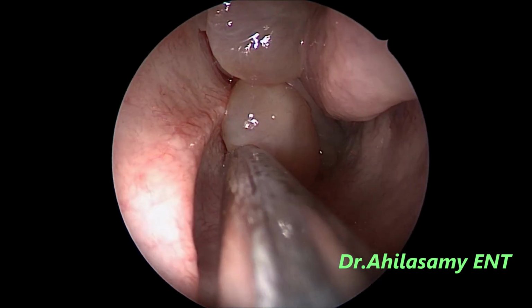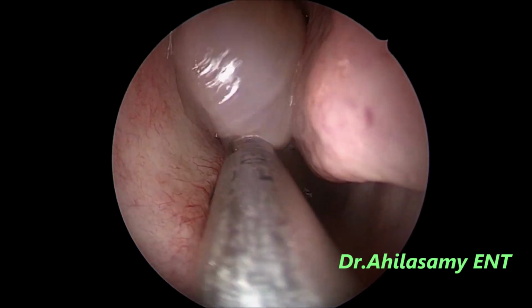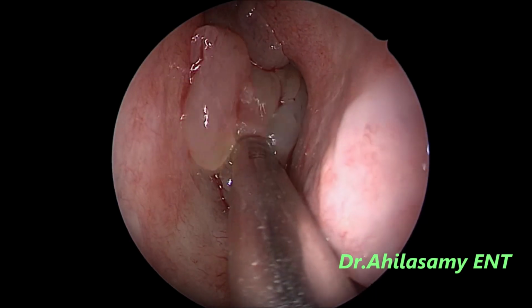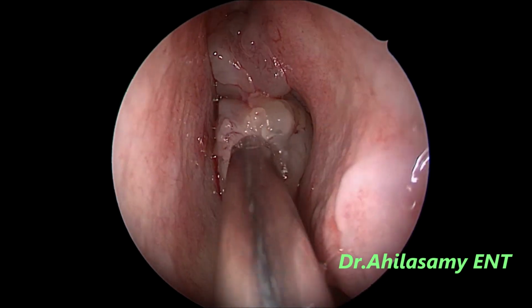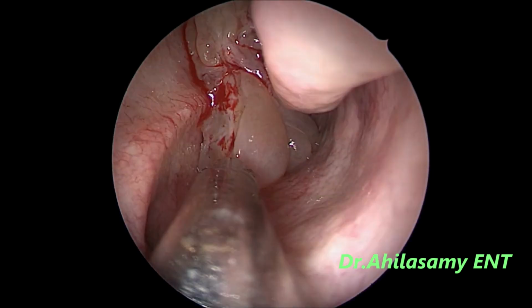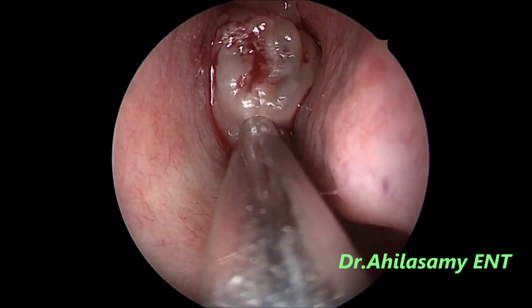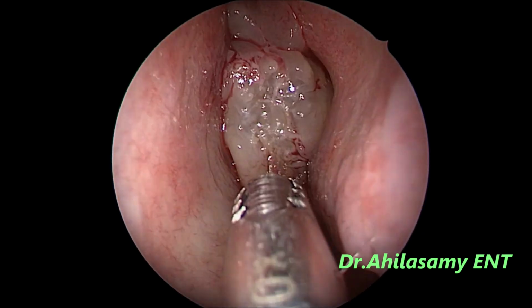Now I am using the shaver to take out the polyps. In fact, this is a shaver I bought from Vansari Marketing in 2006, around 18 years back. Still, it's doing a good job. And I use Medtronic and Xomed debrider blades.